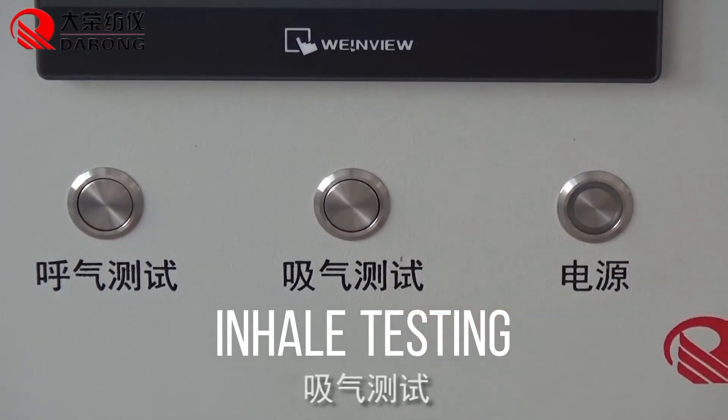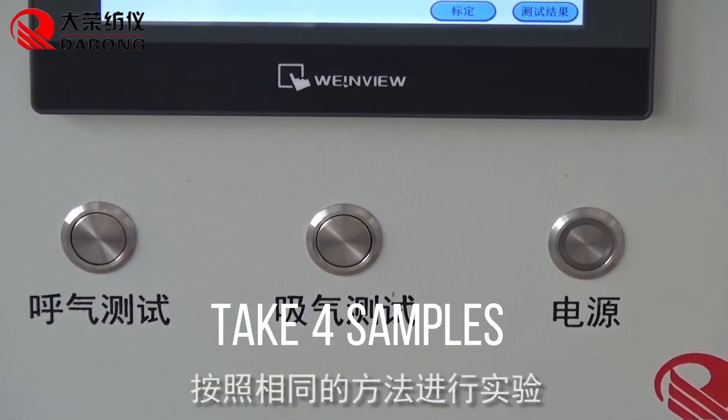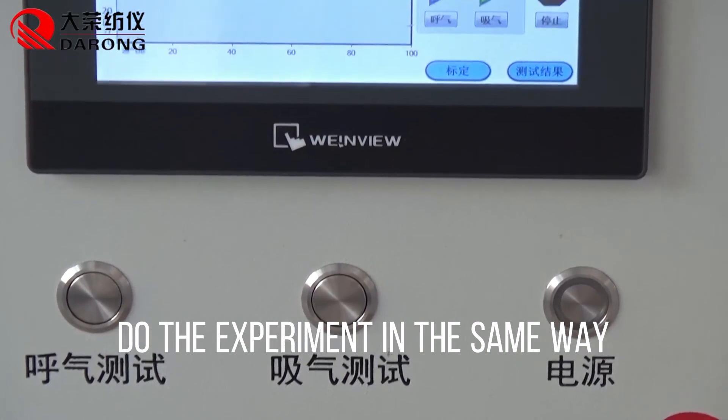For inhale testing, take four samples and do the experiment in the same way.